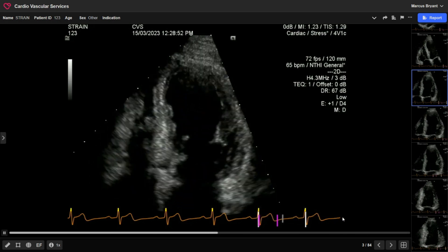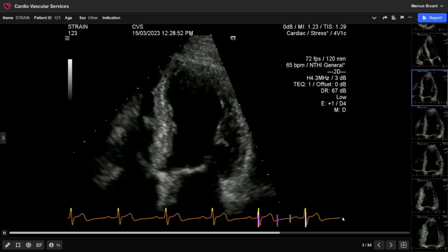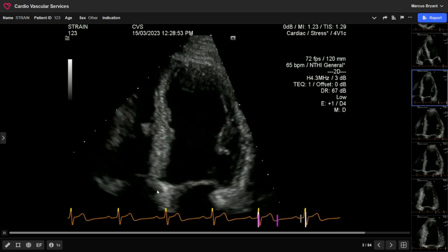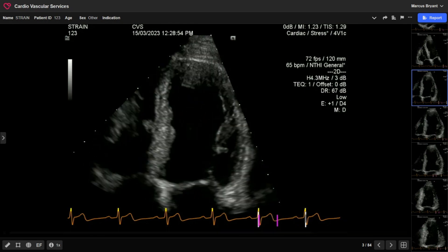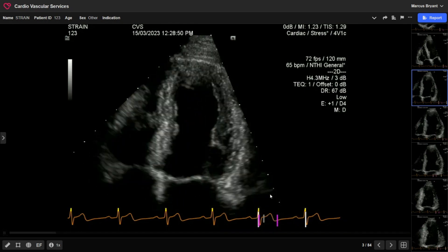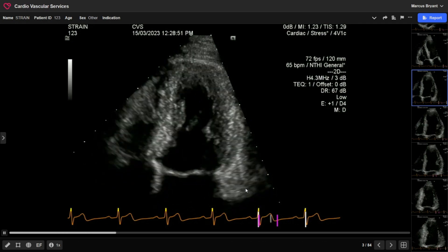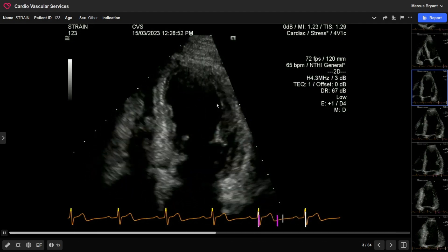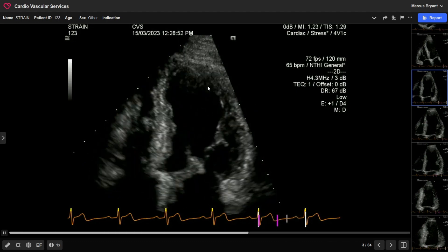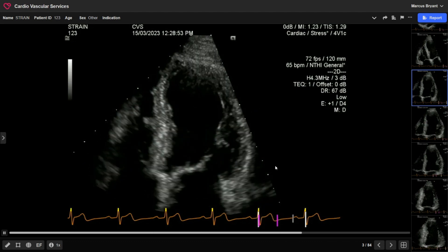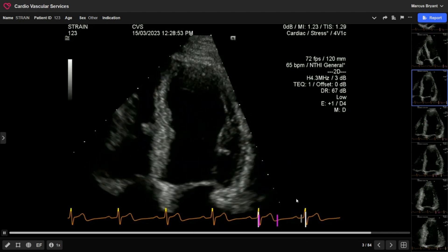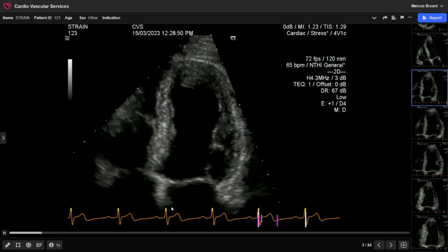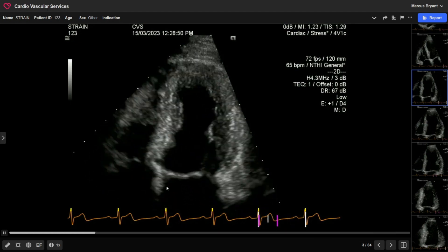In this video I want to go through the practicalities of actually obtaining strain images. When getting a picture, I'm trying to have the sector width as narrow as possible, but I want to include the epicardium and endocardium throughout the cardiac cycle. It should have been a little bit wider on the lateral edge, but I'm also trying to maintain a decent frame rate. I want to make sure I've got adequate depth so I don't lose the mitral and lateral annulus.